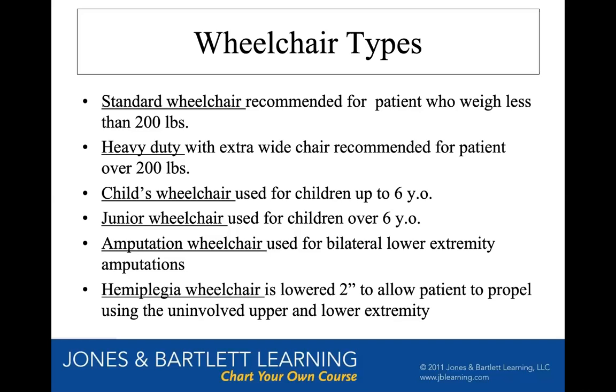You would think a kid wouldn't know how to work a wheelchair. It takes 5 minutes for a kid to learn how to propel a manual wheelchair. And with a 5-year-old, you've got to give them a little time to learn how to drive a junior power chair. You've got to make sure they're safe and they're not going to run into walls, run through windows, or run over the family dog. But after a while, little kids, even toddlers and kindergartners, can learn and be pros with power chairs. You would be really surprised at what little kids do out there.